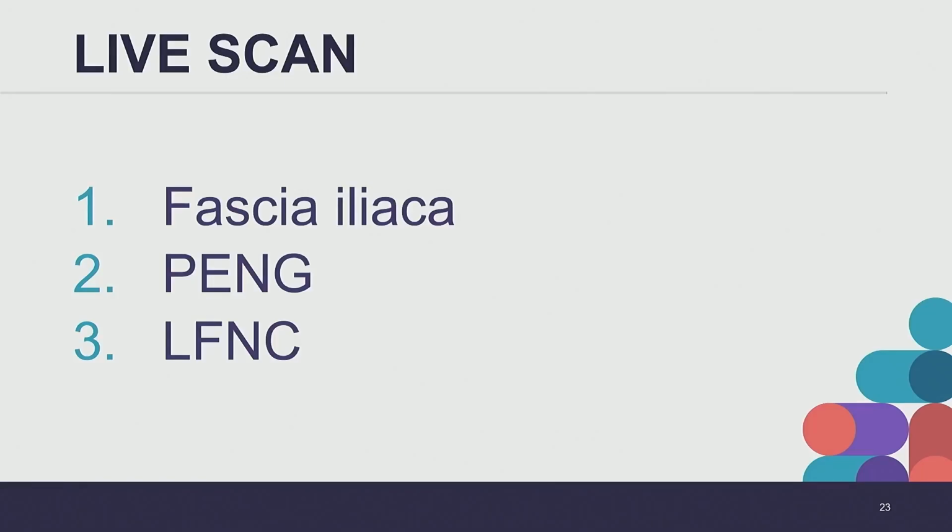So if you could point. In a high BMI patient, is the suprainguinal fascia iliaca amenable, or do you have a BMI cutoff, or do you always prefer suprainguinal? When will you go to infrainguinal? Yeah, that's a great question. Does the BMI affect the technical challenges of doing a suprainguinal fascial block versus an infrainguinal or the classic fascial block?